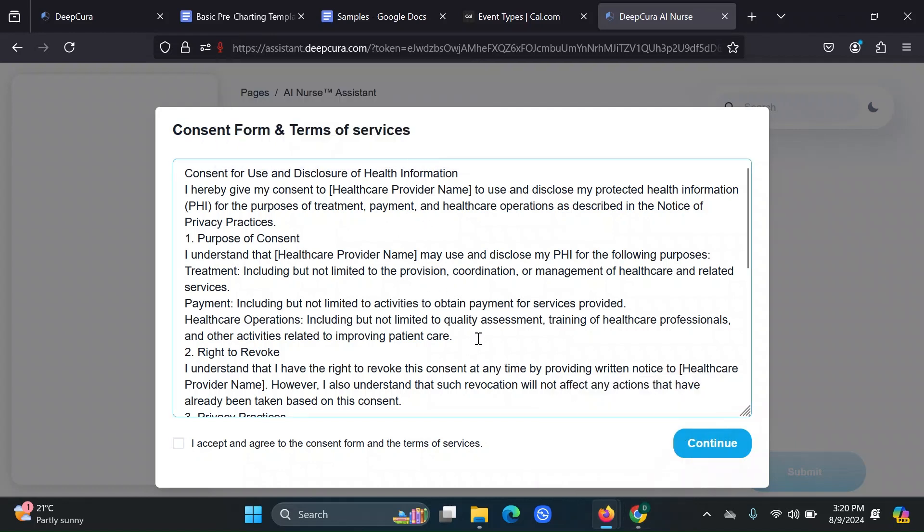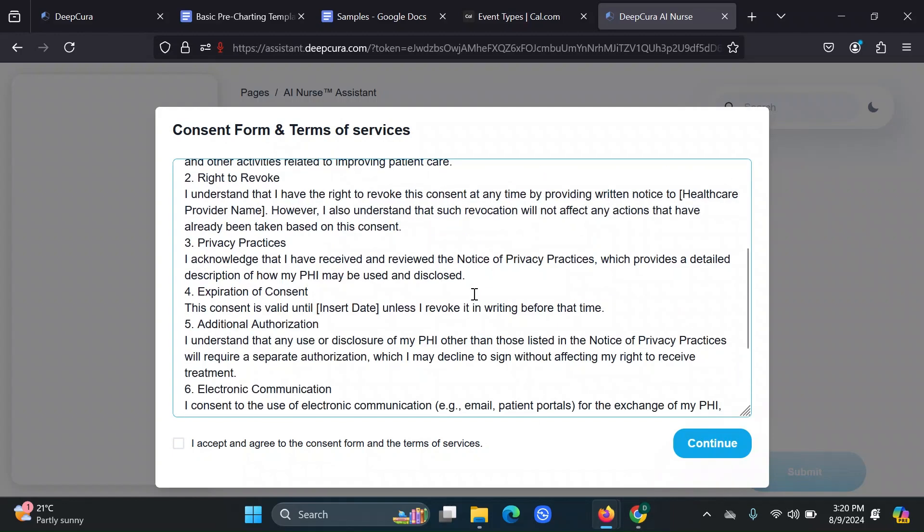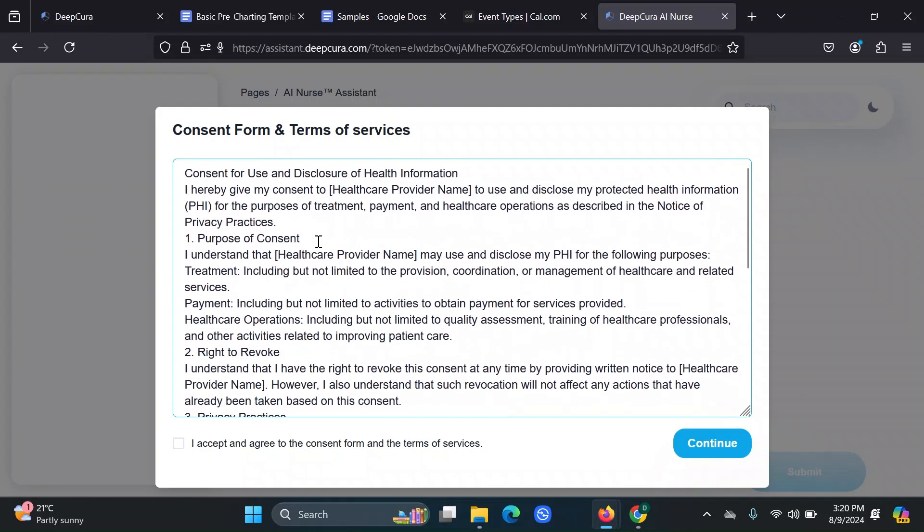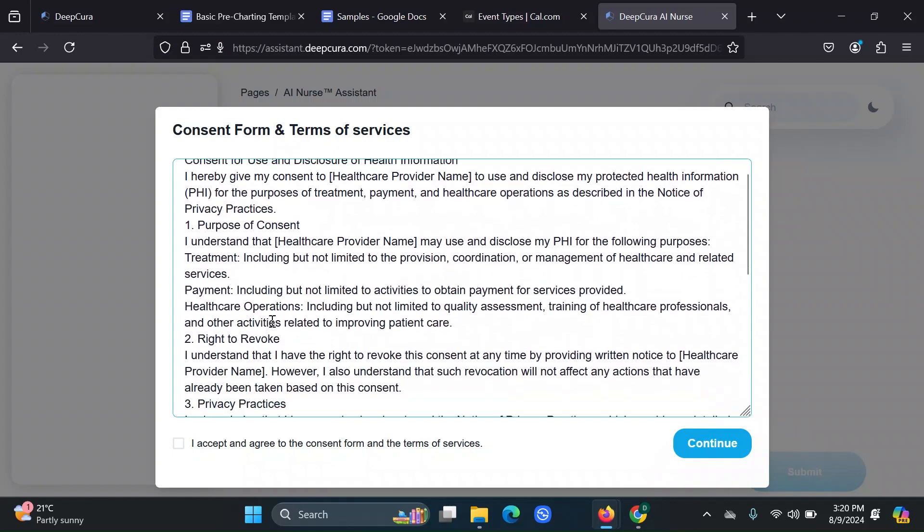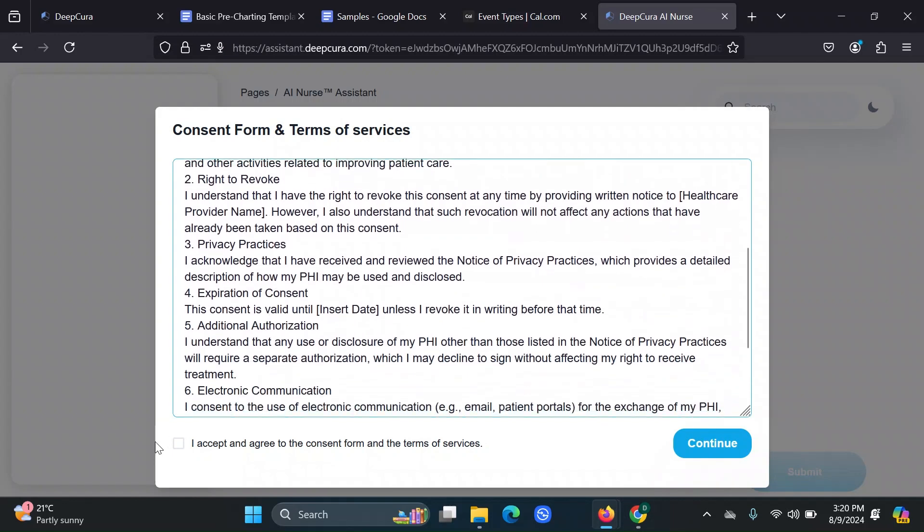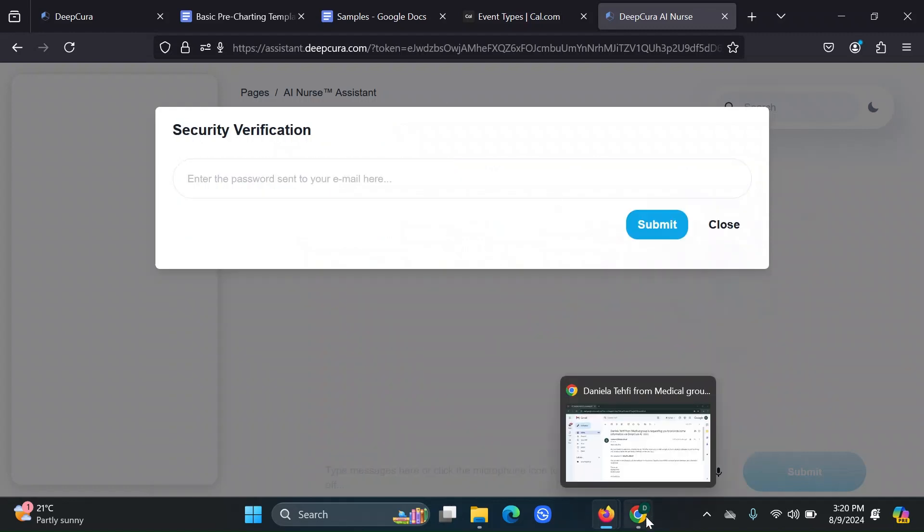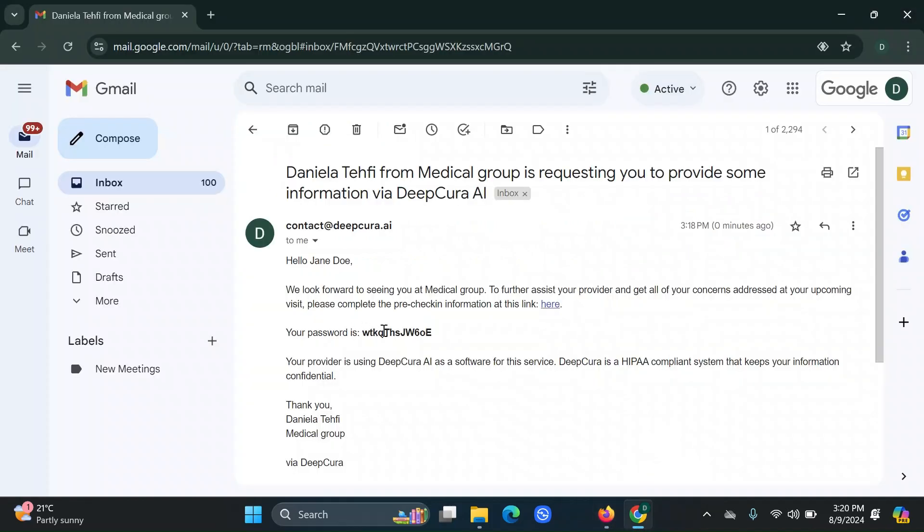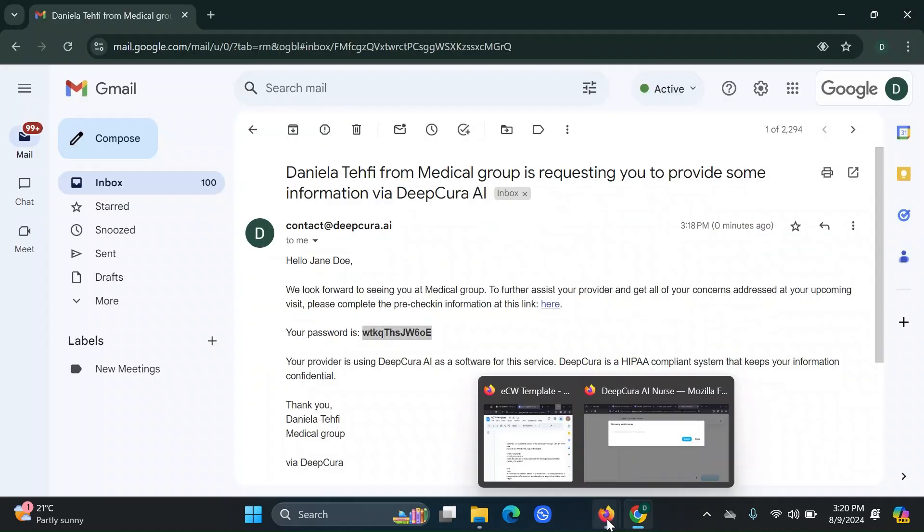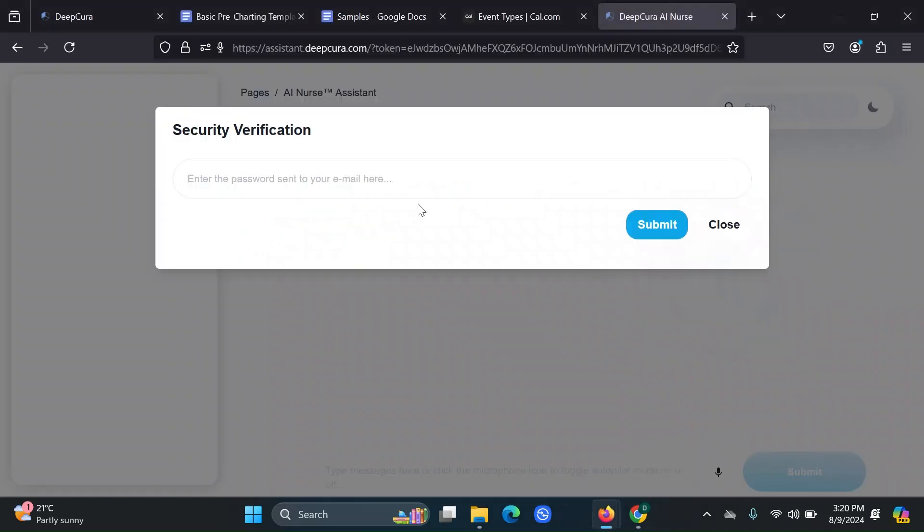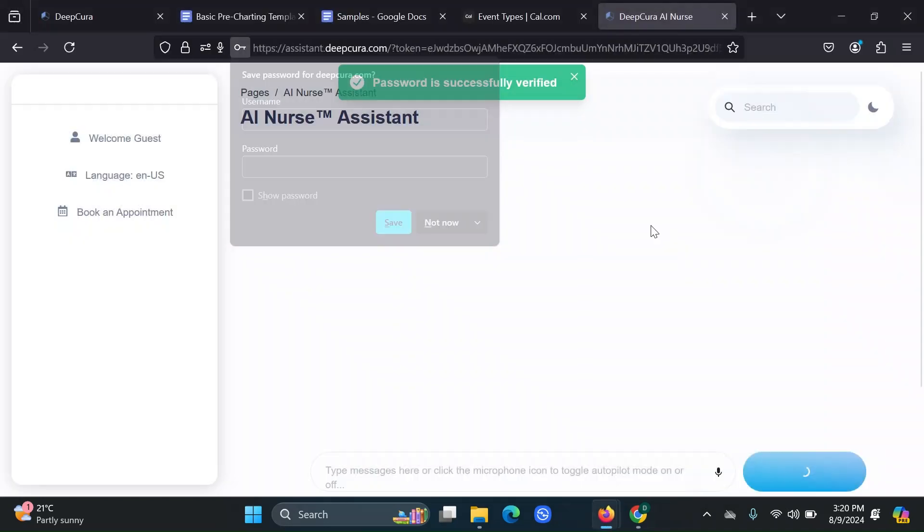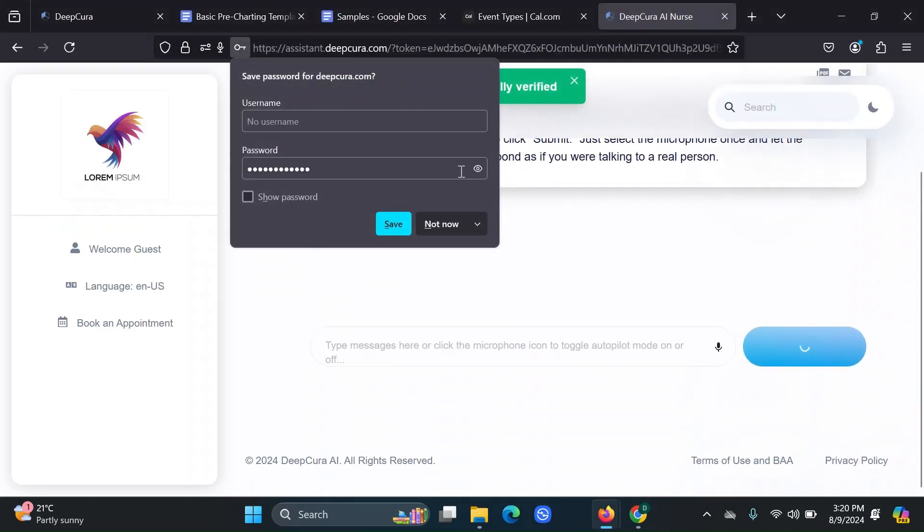Allow the microphone. The first thing we see is the consent form and the terms and services that you added. So the patient needs to click on I accept and agree, and then click on continue. The next step is adding the password that they received in the email. Let's go ahead and paste that in there and submit.